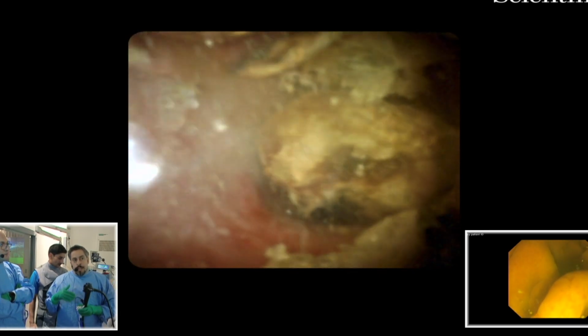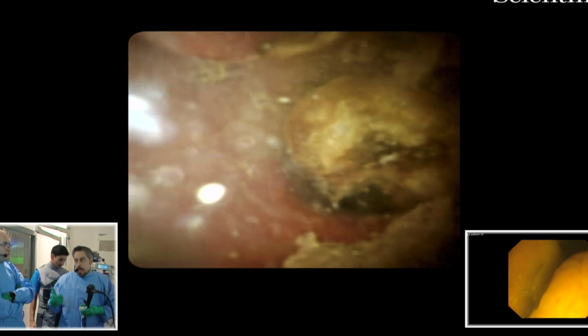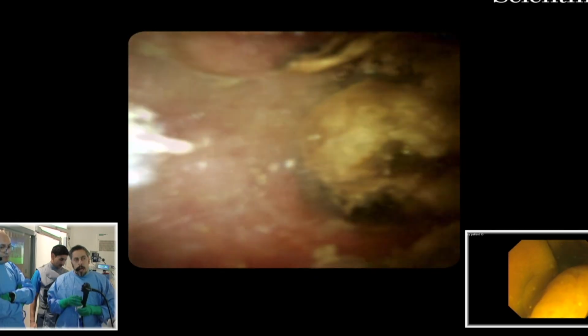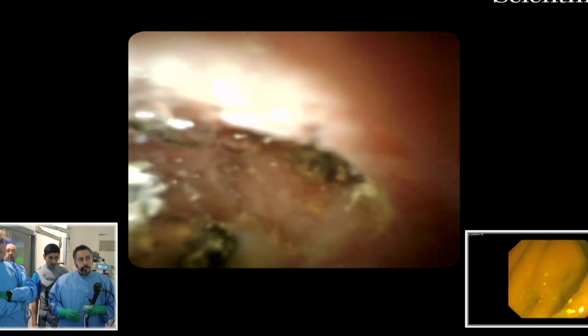And again, if the case is in favor of benign structure, so if there is a clear-cut cause for benign structure, like in this patient, he's young, he's healthy, and he has a stone, so I have almost zero suspicion that these changes here are concerning for malignancy.